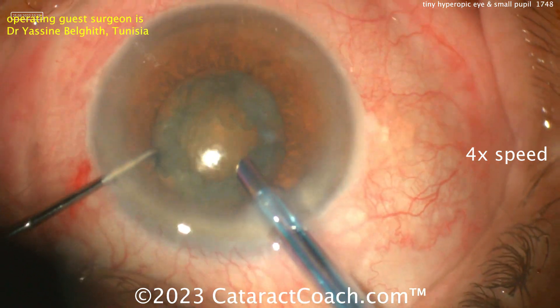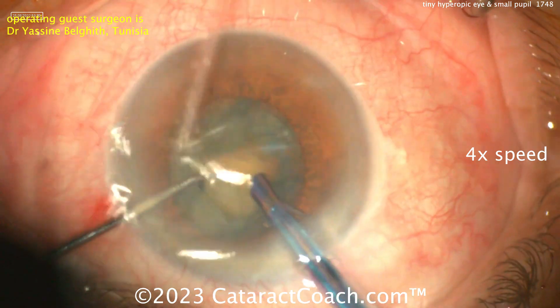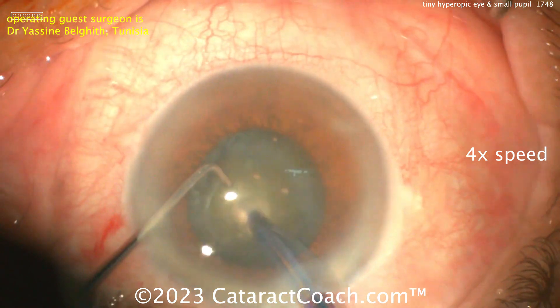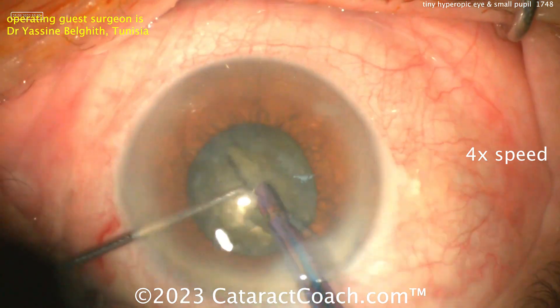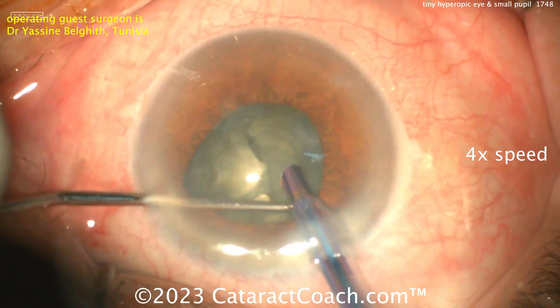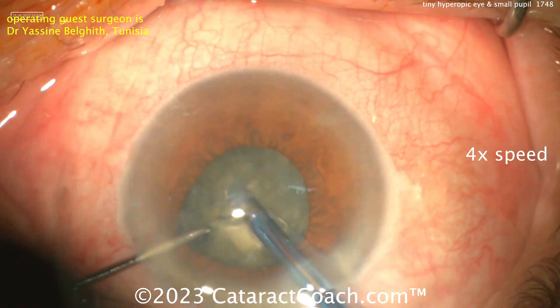Watching the technique — it's probably a chop, has to be a chop right off the bat. A lot of rotating — I love it. Probe going in, horizontal chop, very nicely done. Obviously a very experienced surgeon, which is a good thing.